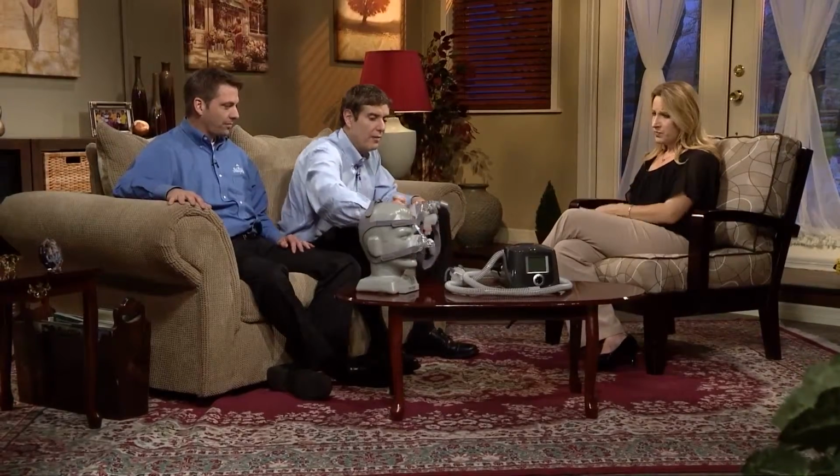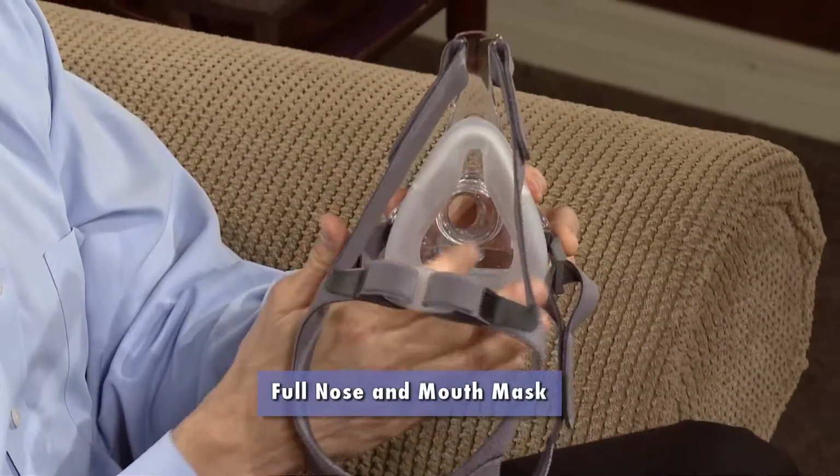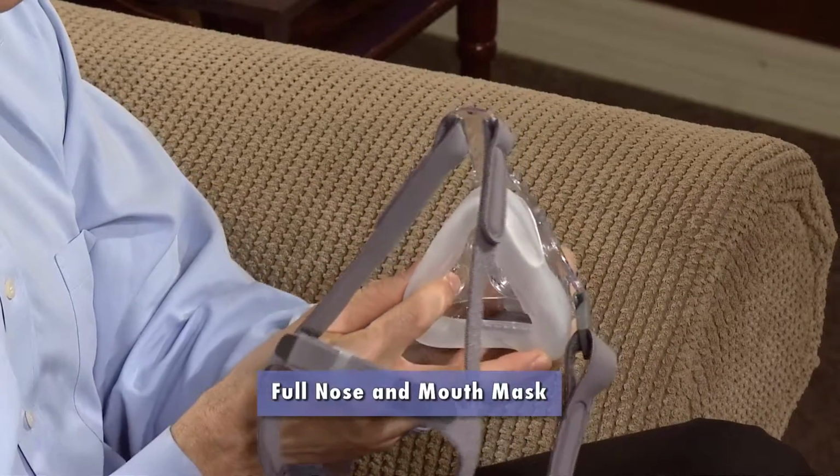All right, and the final one you have. The final one is for patients who have a problem opening their mouth or mouth breathing. So this mask is designed to cover the nose as well as the mouth. Okay, so much like the same configuration for the nasal mask, the head harness is very much the same, but it just goes down a little bit further to cover the patient below the lip. Okay. And so this allows people to open their mouth, and it wouldn't be a problem for the therapy. They won't get so many leaks and dry it out and have a problem with waking up. So that's the last one.